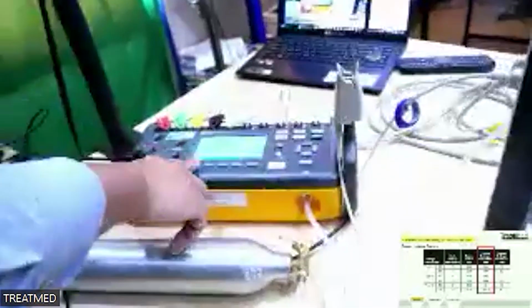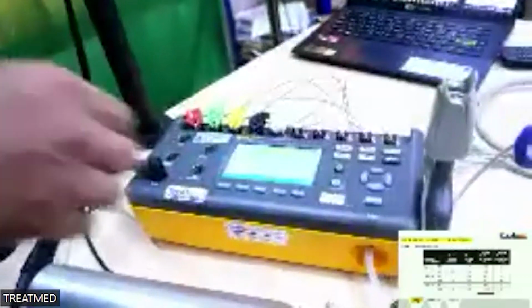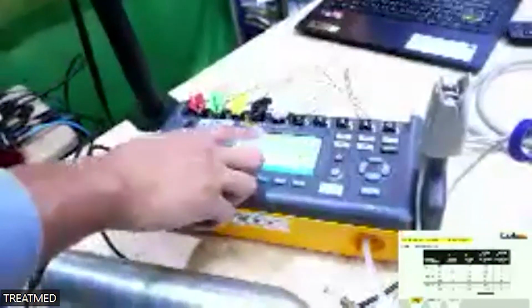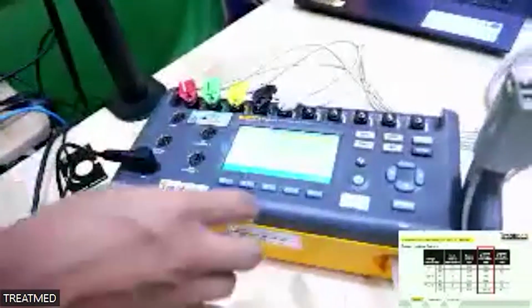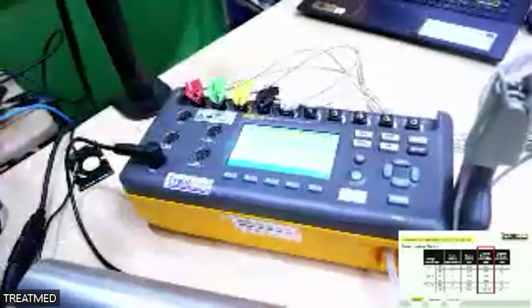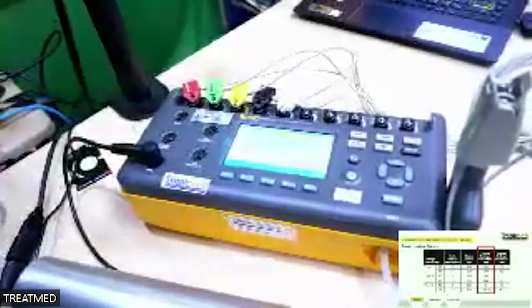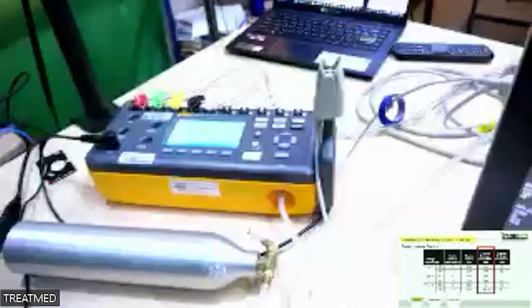Okay, next for the static pressure. For the static pressure, we test the leak test, pressure relief test, and pressure source. For the leak test, we check the leak rate in the patient monitor.